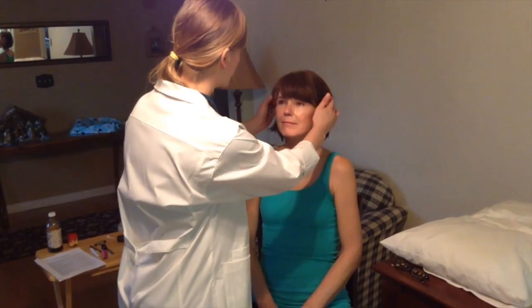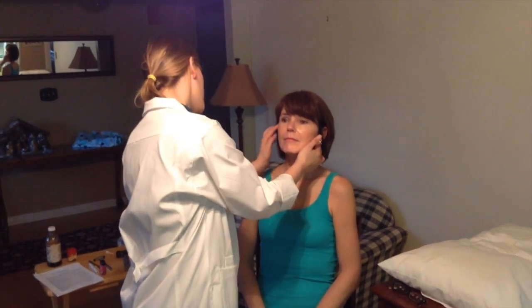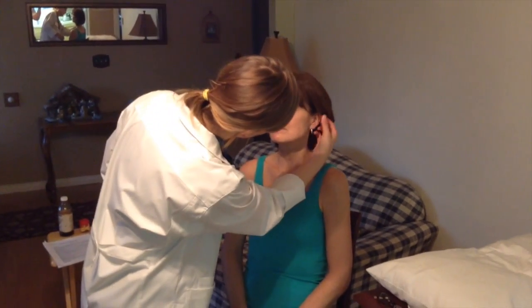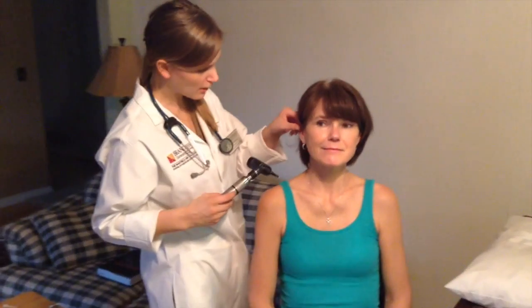I'm going to palpate just around your ears, looking at the mastoid bone, the pinna. Do you have any tenderness as I do this? No. Just going to look over here. Okay. So now I'm going to pull out my otoscope. And I'm just going to take a look at your tympanic membranes, okay? I'm going to pull up on your pinna.